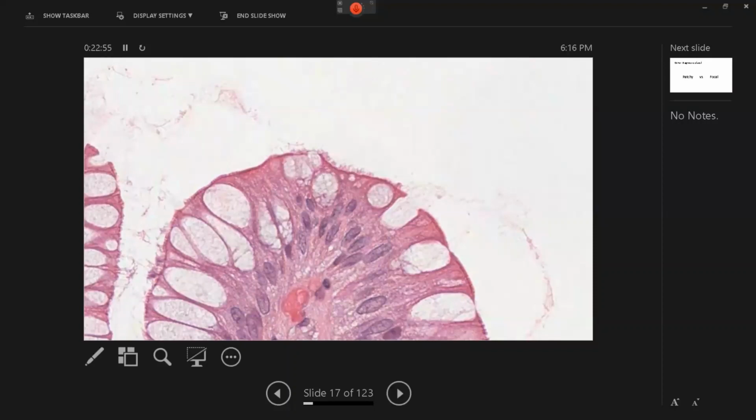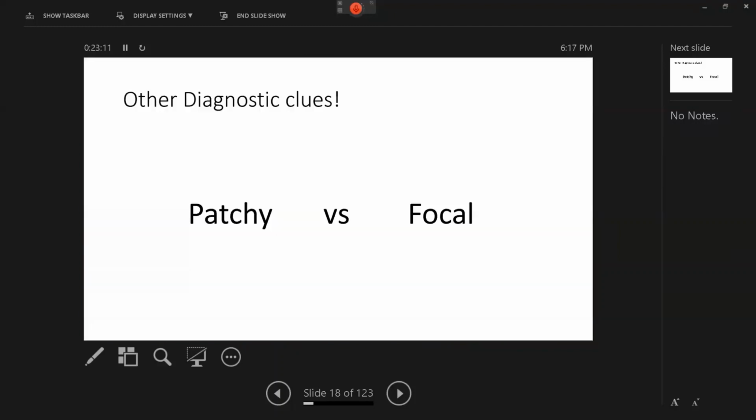And of course, you can use an immuno for this. We don't tend to do the Warthin-Starry study because in the lab it is very time consuming and very labor intensive, but there are special immunos. But don't forget the lumen when we are talking about this.